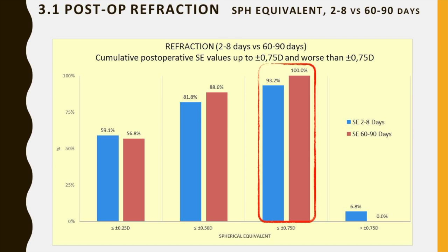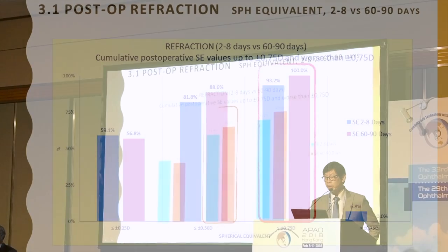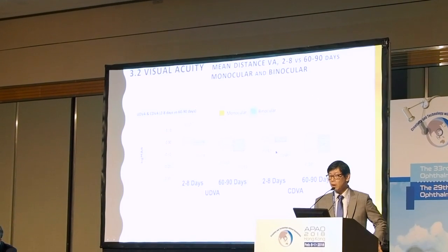93.2% of the eyes measured on the first visit were within or equal to 3/4 of a diopter. And at the last visit, meaning at 60 to 90 days, 100% were within 0.75 diopters. In fact, a high percentage, more than 80%, are within 0.5 or half a diopter at the end of 90 days. How well do they see?